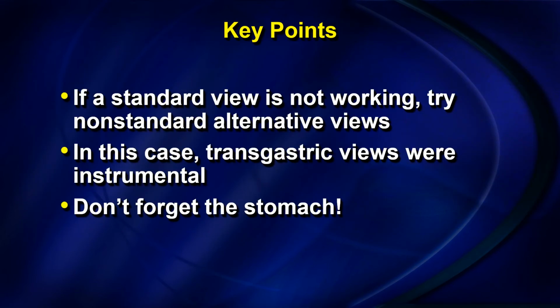The key points are that if a standard view is not working, try non-standard alternative views. In this case, transgastric views were instrumental. Don't forget the stomach. Thank you for your attention.